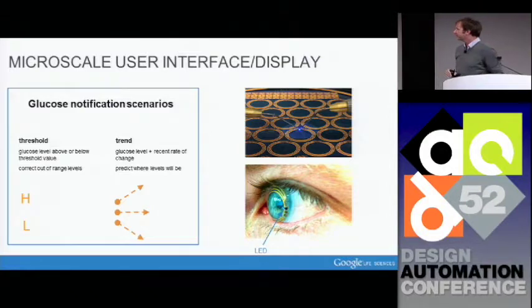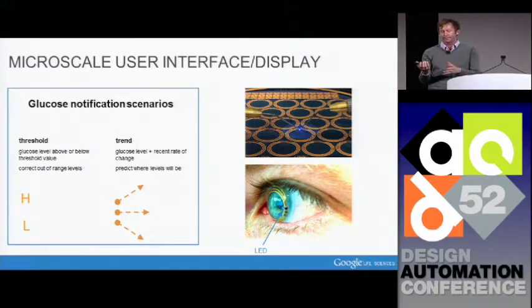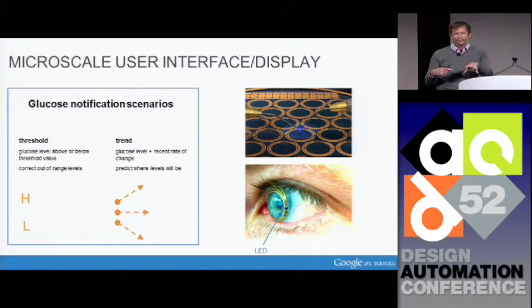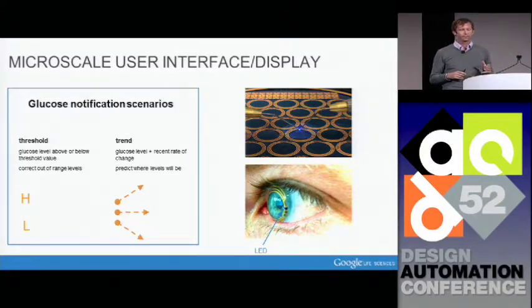And if we can do that, then a person can be alerted through a series of blinks that, oh, I better check my glucose. And then they can take out their phone and look at the time series data or whatever. But there are other ways to encode data in a simple display consisting of a few LEDs. The other is different types of patterns that we can impart on the LED signal to look at trending information. And that could give you, hopefully, even rate of change, which is just as important as the raw thresholds themselves. So I'm pretty excited to see where this goes. But at this point, it's also looking promising.